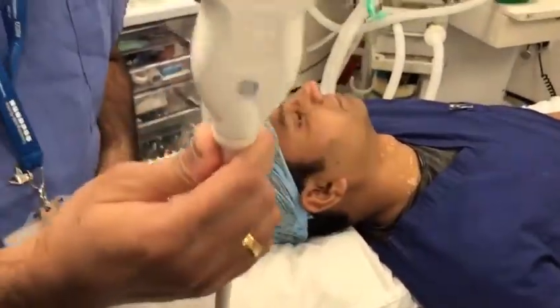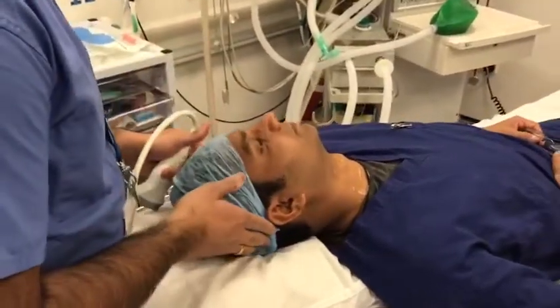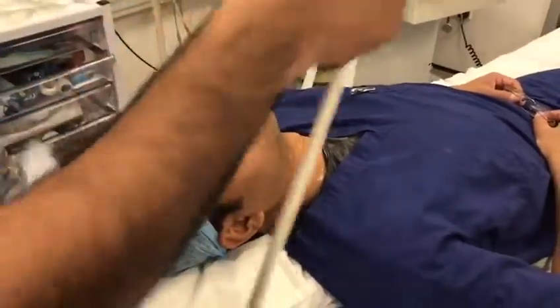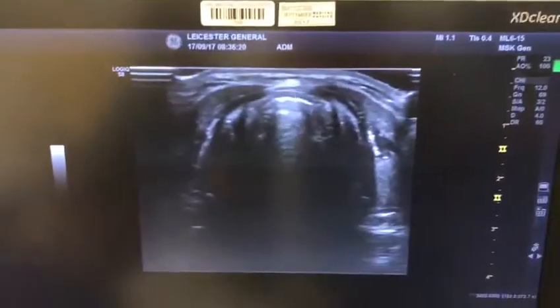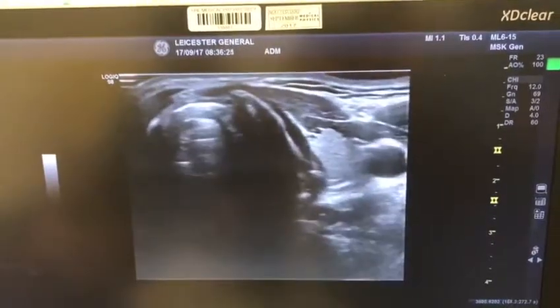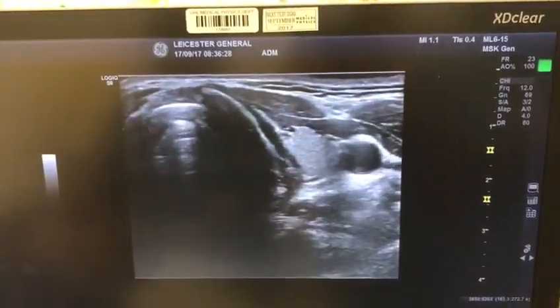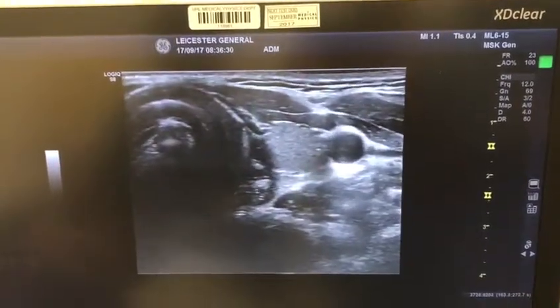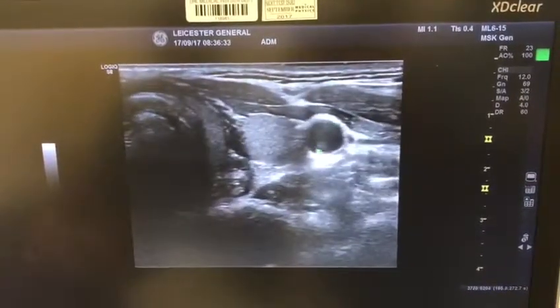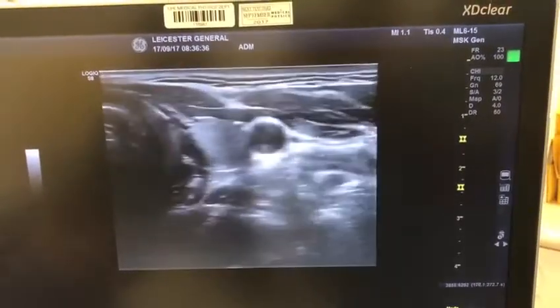In this position we're going to use a high frequency linear probe, and we will start to scan the patient from the midline. Here you will see a tracheal ring, then we're going to move the probe more laterally. You can see the omohyoid muscle, your thyroid gland, your carotid artery, and I'm actually compressing the internal jugular vein.